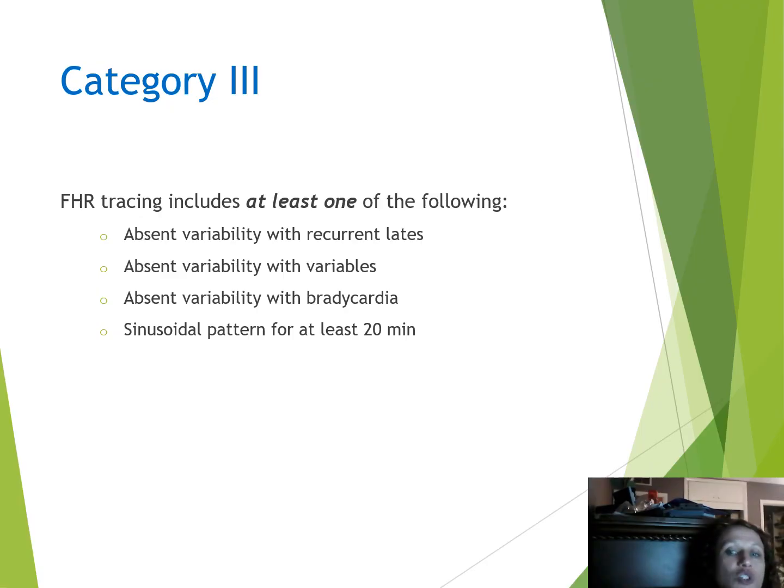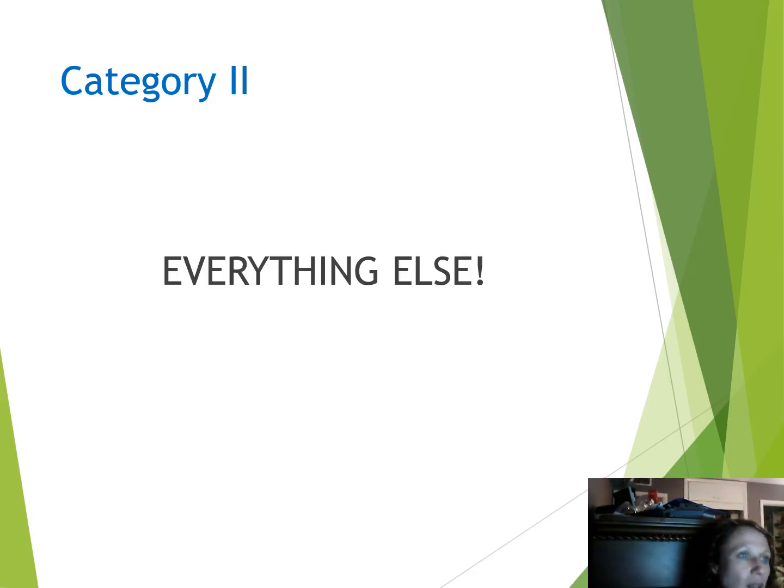Now it says for at least 20 minutes, and the reason is because you can have something called pseudo-sinusoidal. I will tell you, AWHONN doesn't really love that term anymore. We're trying to get away from it just because people continue to see sinusoidal and think that it's pseudo-sinusoidal. But really, if you have a reason, like say you gave a medication like fentanyl, and then you see the sinusoidal pattern, you only have 20 minutes before it needs to resolve. Otherwise, you have to make some decisions because you're category 3 and that's not good.